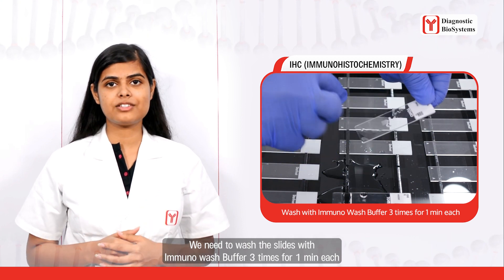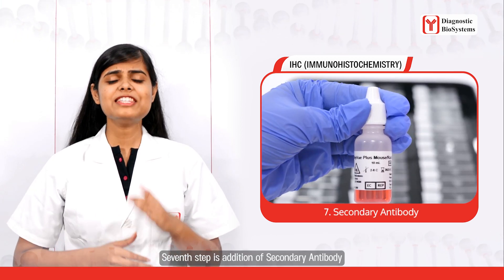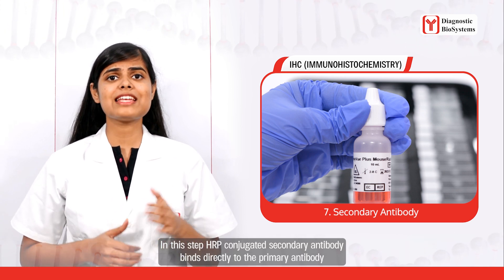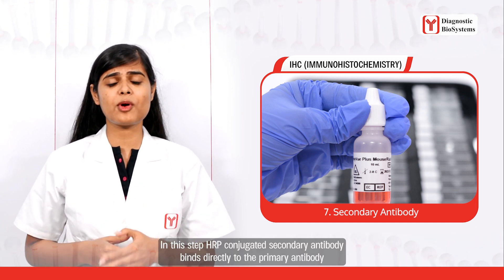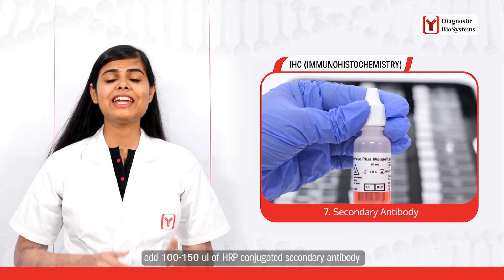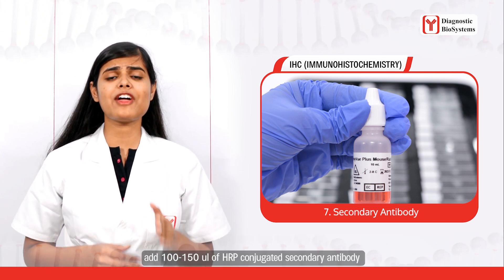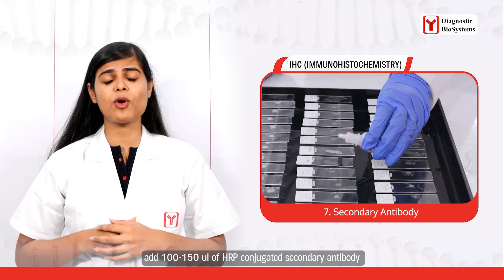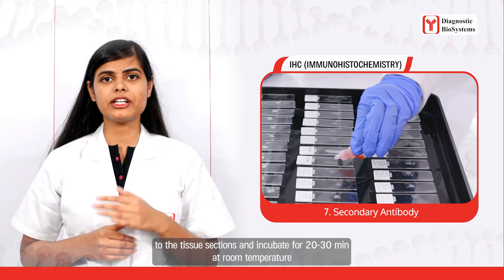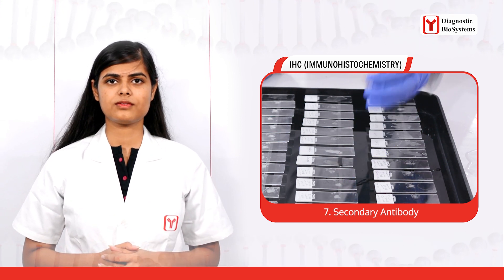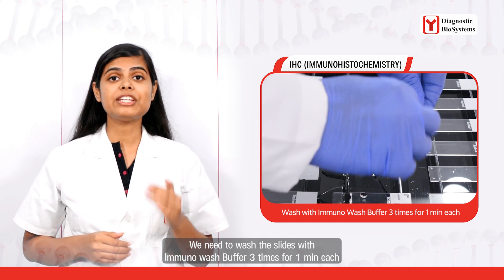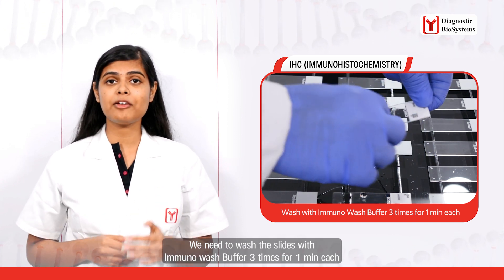The seventh step is addition of secondary antibody. An HRP-conjugated secondary antibody binds directly to the primary antibody. Add 100 to 150 microliters of HRP-conjugated secondary antibody to the tissue sections and incubate for 20 to 30 minutes at room temperature, then wash the slides with immunowash buffer three times, one minute each.